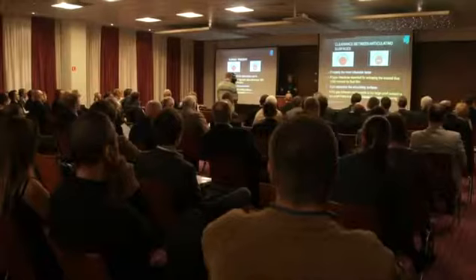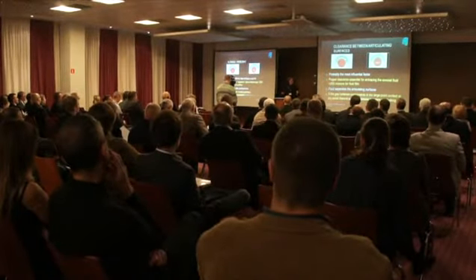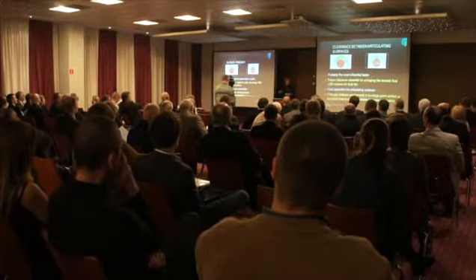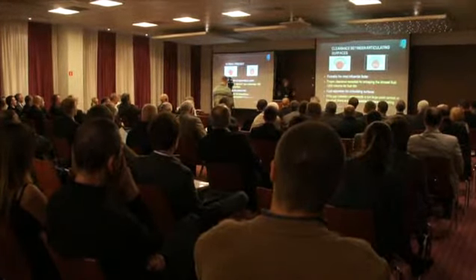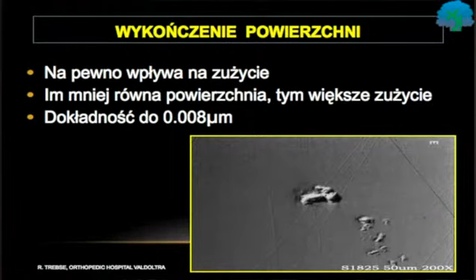And it was actually the basic failure mechanism for the old McKee-Farrar prosthesis, and it is one of the mechanisms for socket failure in resurfacing in, for example, the Australian registry. Surface finish is obvious. The higher the surface finish, the higher the lambda, and the better the lubrication.